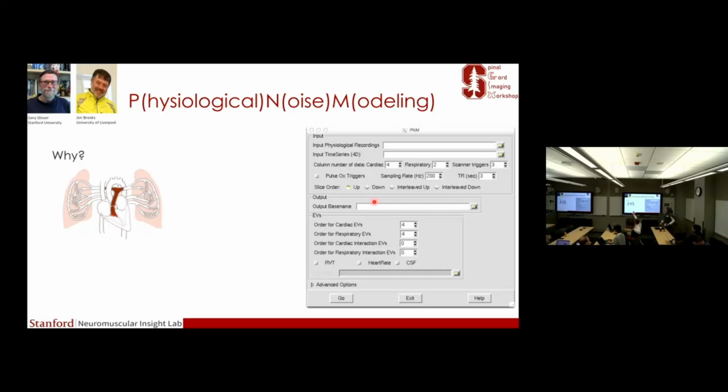And then what John Brooks pointed out as being the optimal, but it's several years old, I think that's a 2008 study. So we can probably do a better job at optimizing the noise modeling. For example, we use 32. I know Dimitri's group uses 18, and Alexandra Tinnerman's group also uses 18.